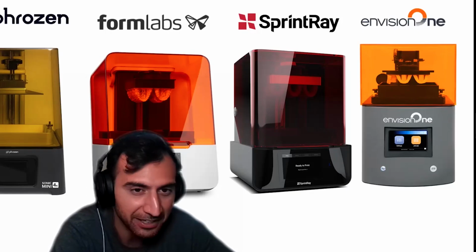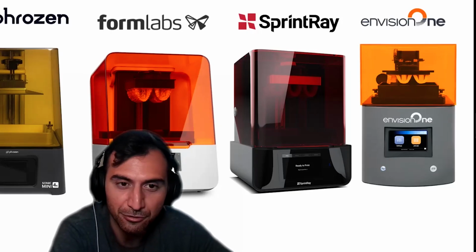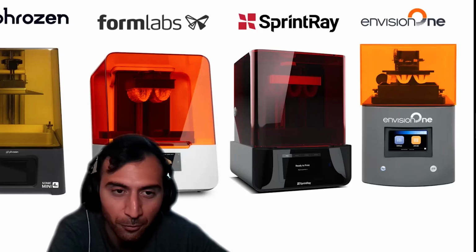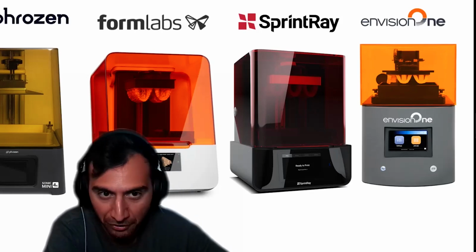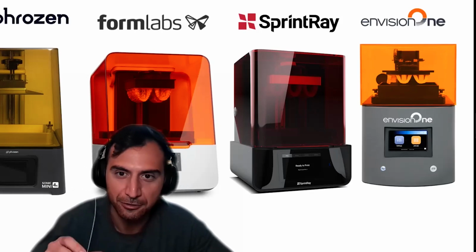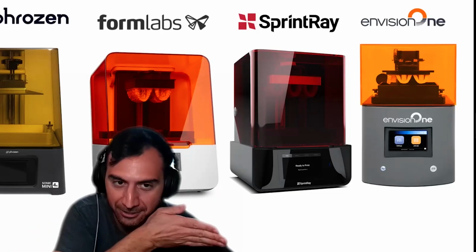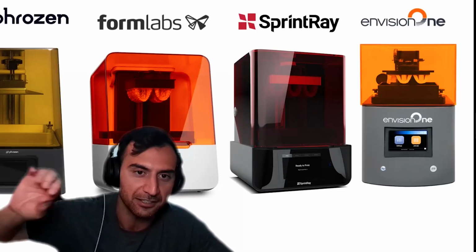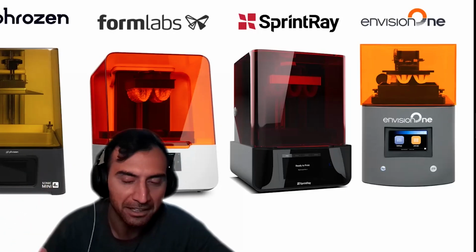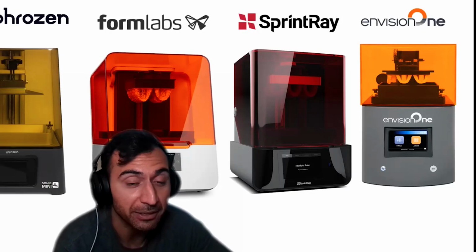Unless you're cranking out like 30 arches of teeth because you're doing suck downs for ortho cases, trying to create a bunch of clear aligners, so you need to print like 30 models where the teeth are just slightly turned each time so that it creates a series of aligners that can move the teeth. You really don't need those stupidly expensive printers. You're not going to benefit as much from them. It's going to be hard to get an ROI on it, basically.